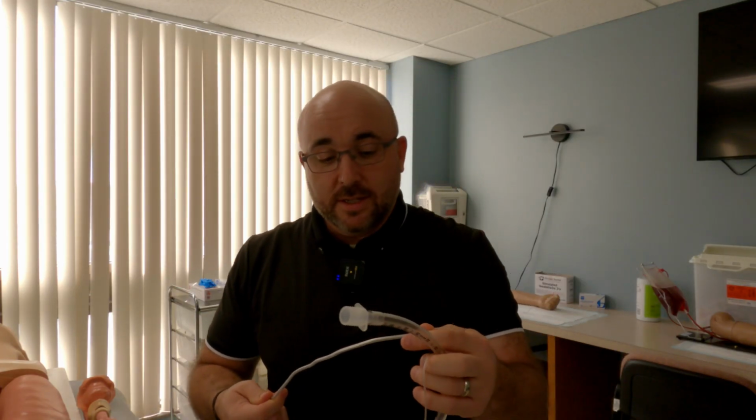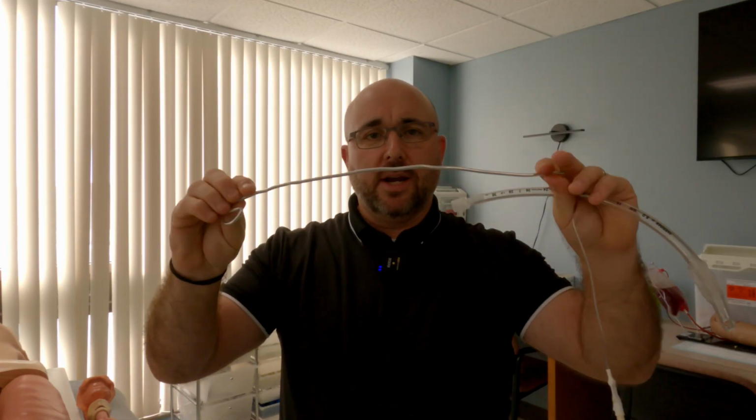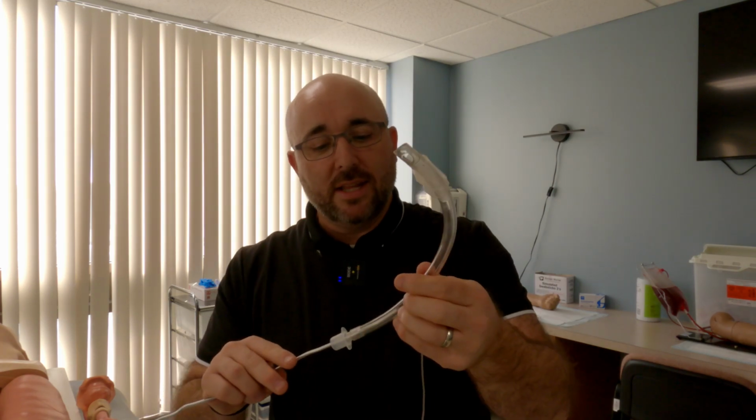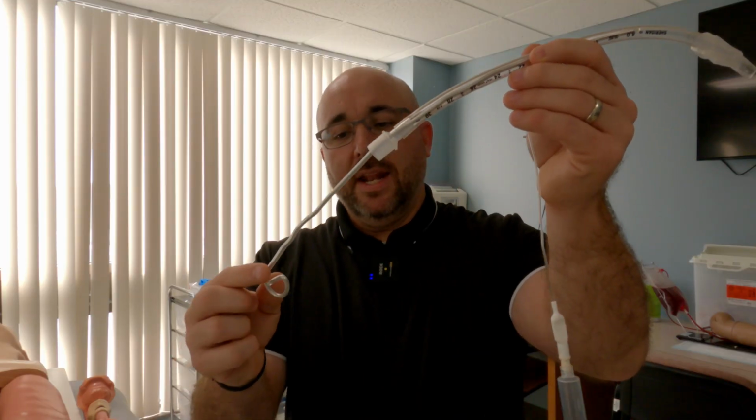The next thing you're going to use with the endotracheal tube is going to be your stylet. And this is a semi-rigid stylet. They usually come in a package where they're packaged somewhat straight like this. This one's already been bent a bit, but you're going to insert this thing inside the endotracheal tube. So this goes inside the endotracheal tube, as you can see here, and it's curled at the end.